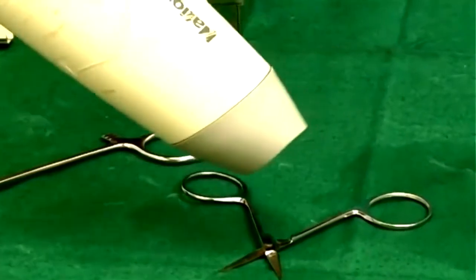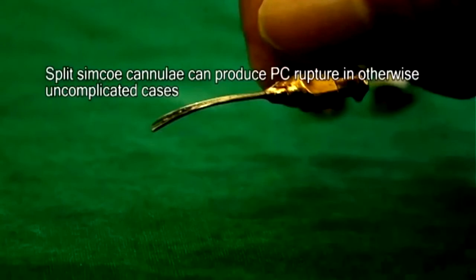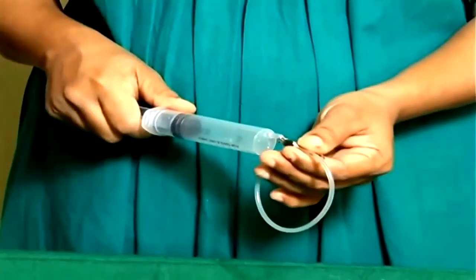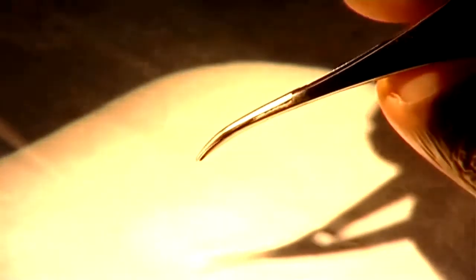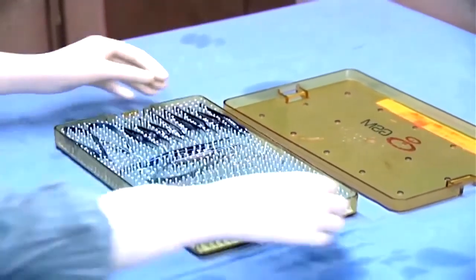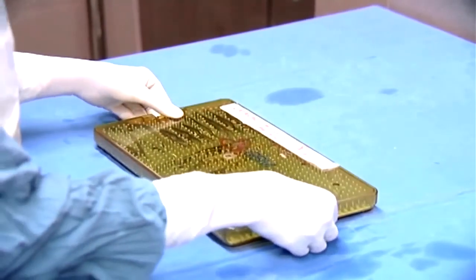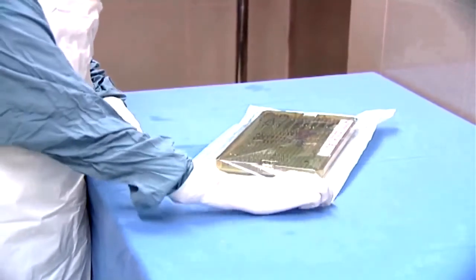If it is urgently needed, you can use an air dryer. Dry, check for the sharpness of your instruments, split Simcoe, cannula. You can examine them under the microscope and pack them carefully so that the sharp instruments are not damaged while packing. Trays like this are ideal for packing. Use pouches for autoclave as well. Packing methods are being demonstrated here.